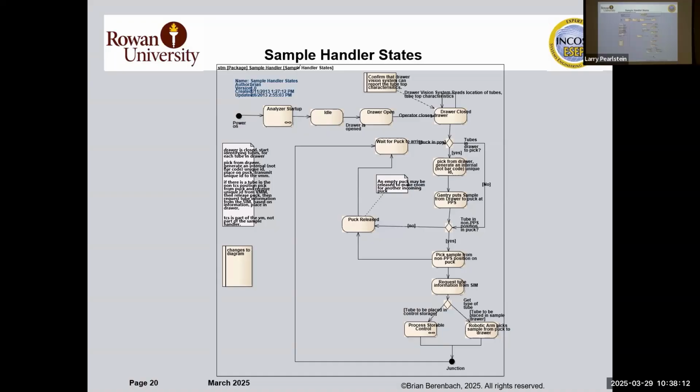And here's the puck sample, and here's a request for information. So when it gets to the station and you get information, what are you? I'm going to analyze you. I'm not going to analyze immunoassay in the chemistry section, obviously. And here we have something else. We have the ability to store the blood in a refrigerated area. So the analyzer actually has a storage facility for racks of samples that they put on hold for recall later. No person touching them.